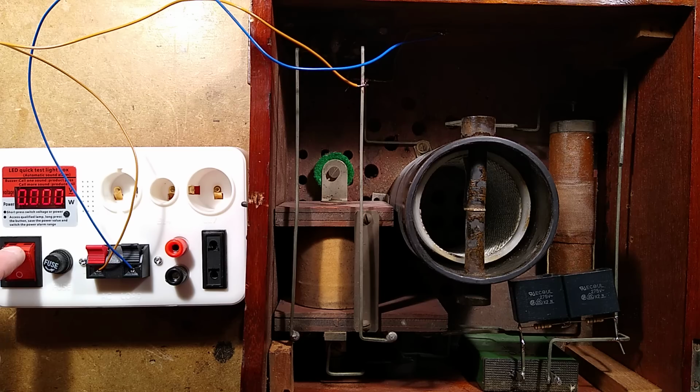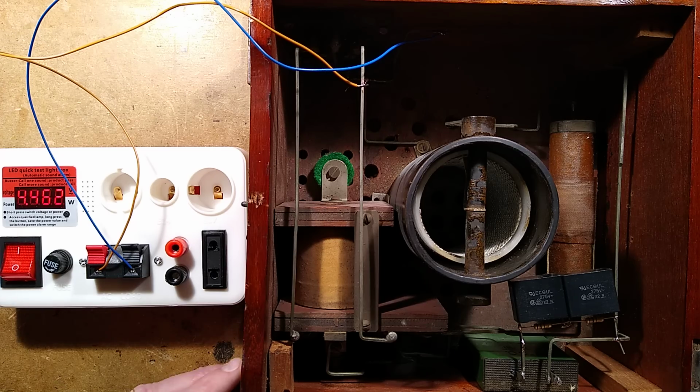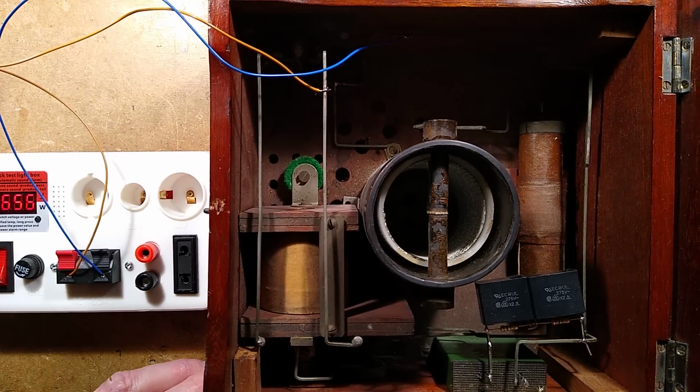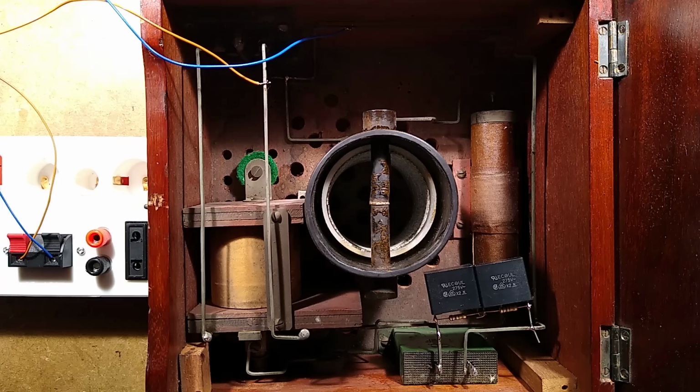This is going to make a lot of noise. I'll just warn you in advance, this is going to make a lot of noise. It's not too bad, 5 watts. Now, if I push this into the middle here, and I turn the light off, take the exposure off, are we going to be able to see? No, we're not. We're not going to see that.